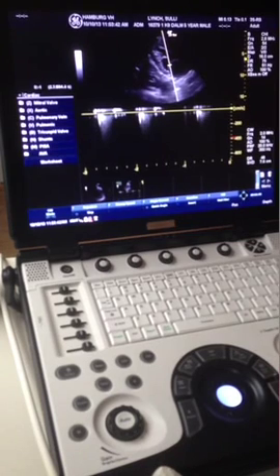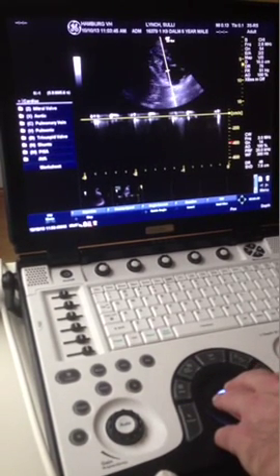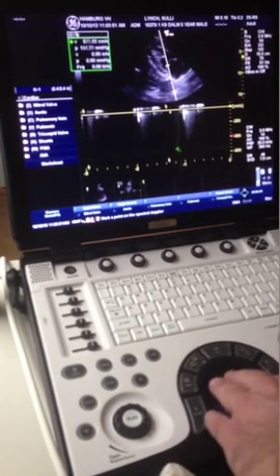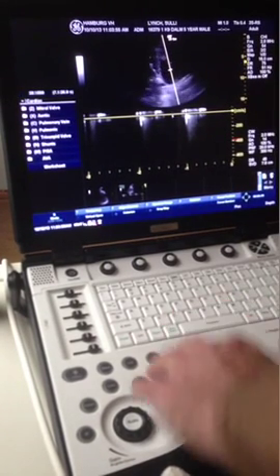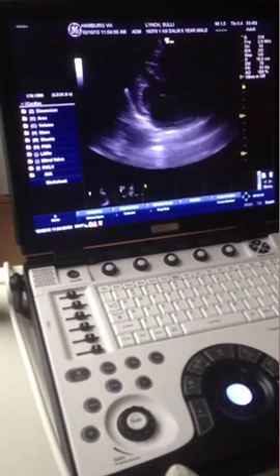That's a little bit better. It's not a really wide jet, so you just have to keep fishing around until you get it in pretty clean. 4.81 — that's about as good as I'm going to get. Usually it'll be around 5.2 to 5.4 and so forth.